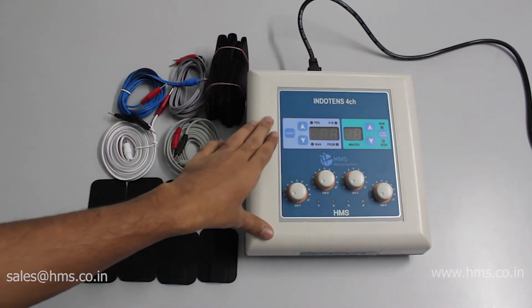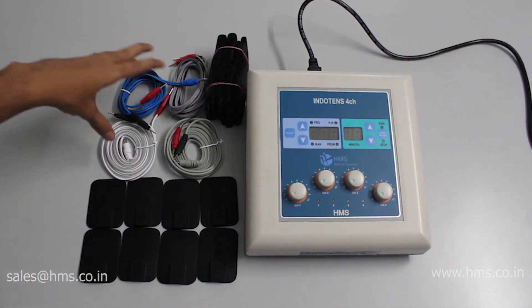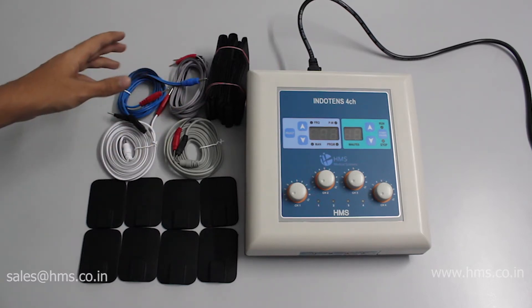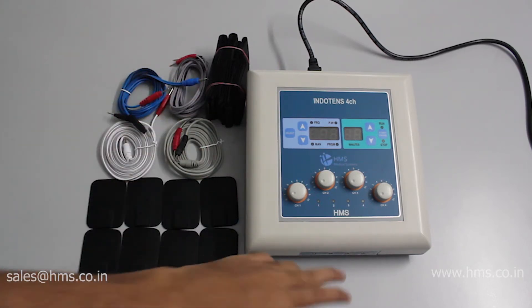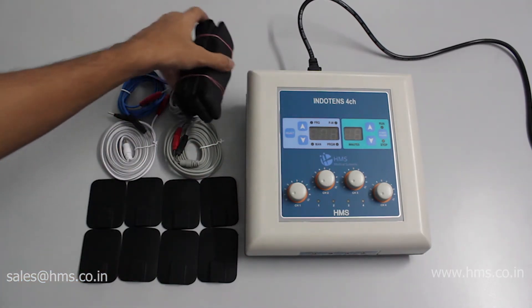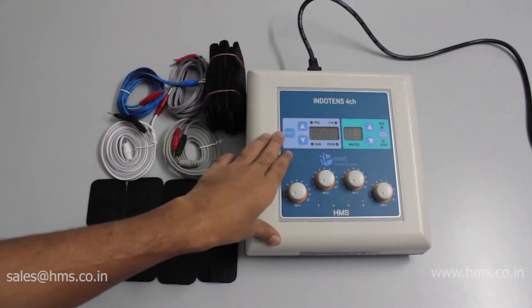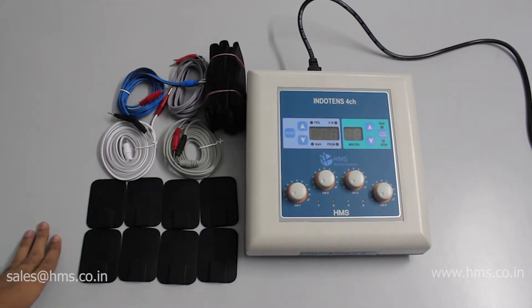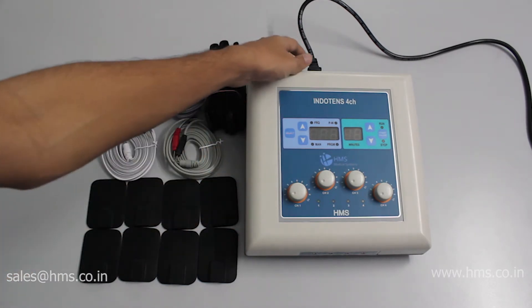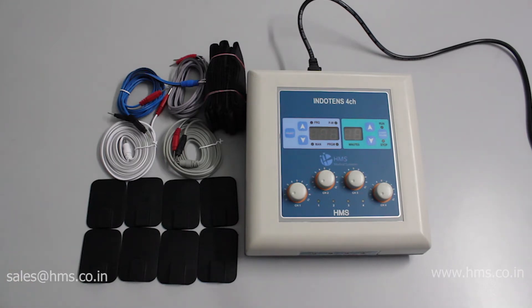Since this equipment has four different channels, we provide four pairs of electrodes and four different cables. All four cables have different colors to differentiate between the channels while giving treatment. We also provide straps to stick the electrodes to the patient, and a gel is included when the equipment is delivered. A mains cable also comes along with the equipment.